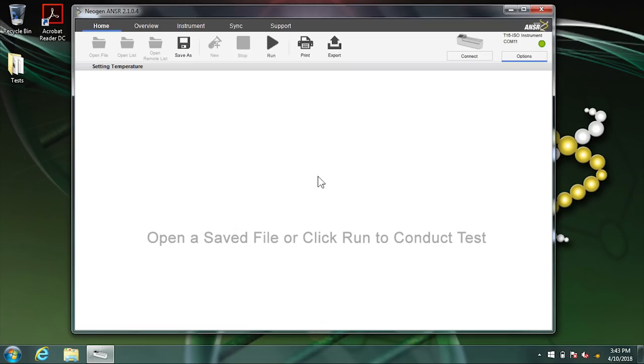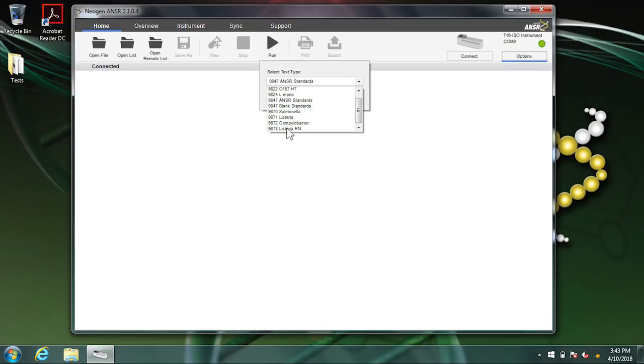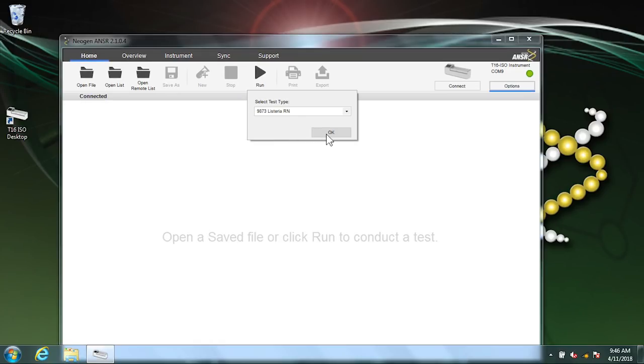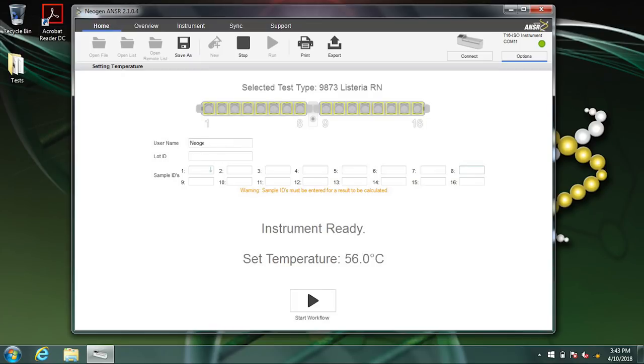Remove your gloves and from the computer, select Run. Select 9873 Listeria RN from the Test Type drop-down menu, then click OK.